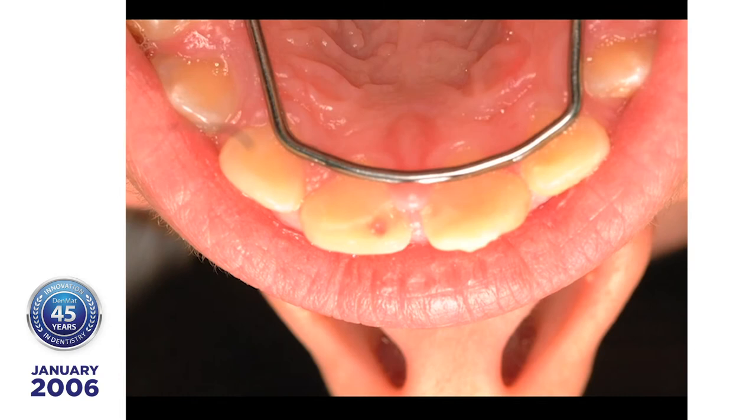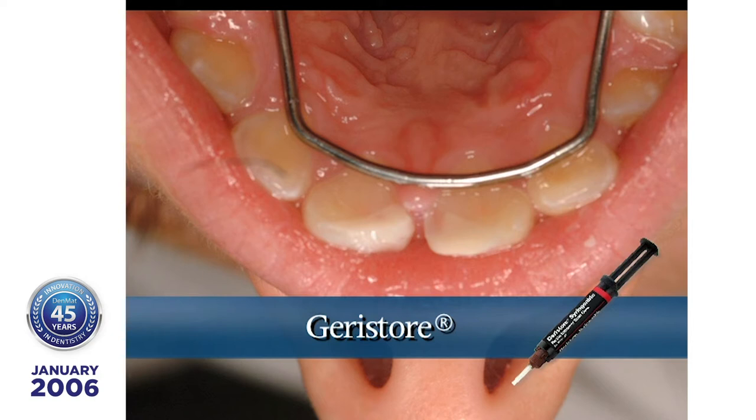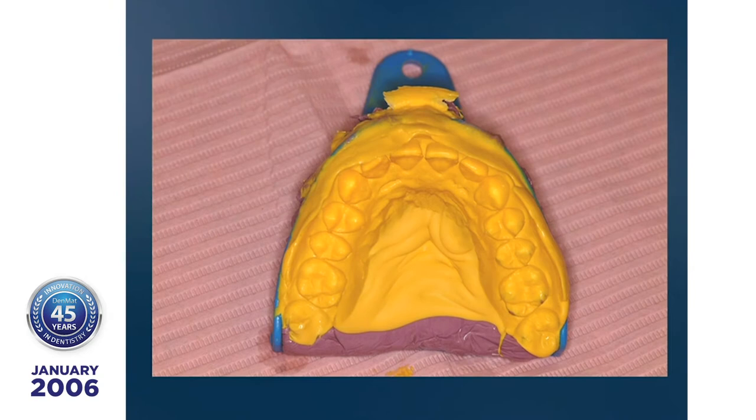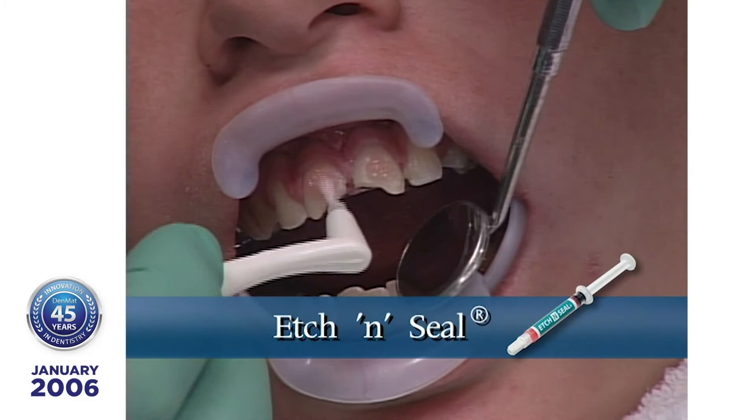Geristore is a biocompatible restorative material that can reduce sensitivity when treating traumatic wounds. After protecting the pulp with Geristore and Tenure, an impression is taken and the lumineers are fabricated. At placement, the teeth are cleaned and acid-etched with Etch-and-Seal Medium Viscosity Etchant. Leave the etchant for 10 to 20 seconds, then rinse thoroughly and air dry.